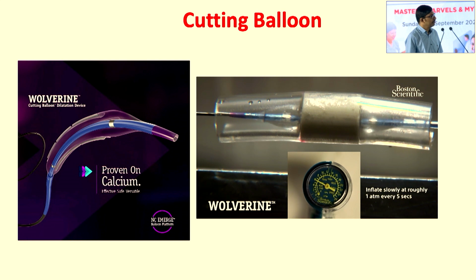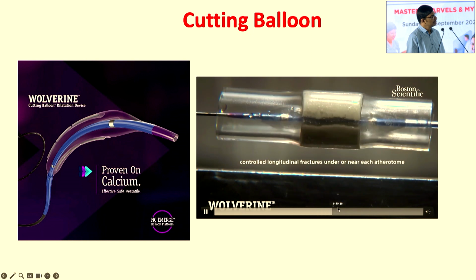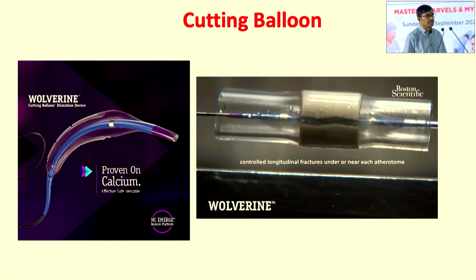Just slowly expand. You can just see how it shatters the calcium. You can just see how it cracks the calcium.